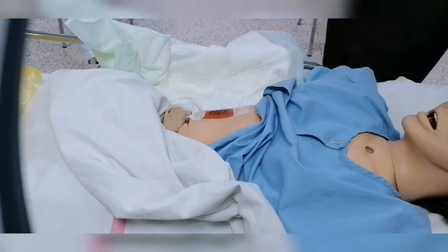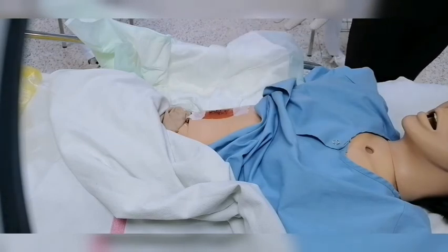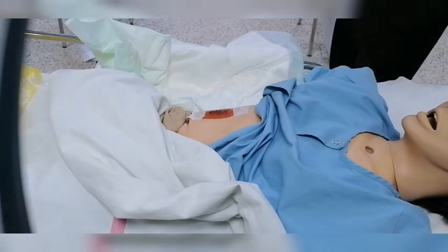If there are any obvious changes that are not expected, I might report it immediately to the physician. So those are the things that we have to observe during or before putting those. Then after that, I have to wash my hand.